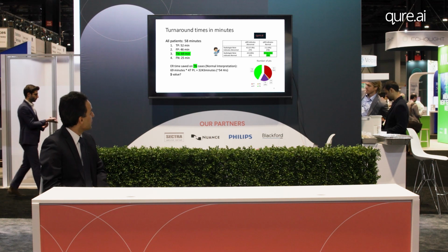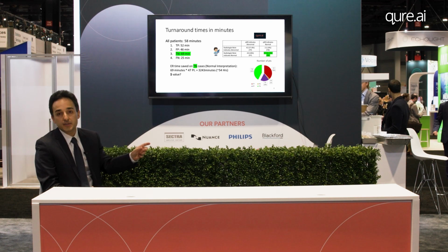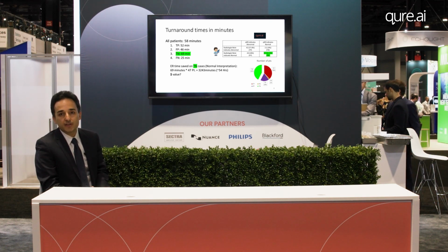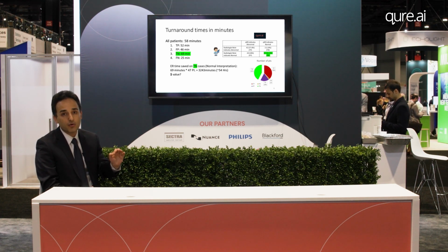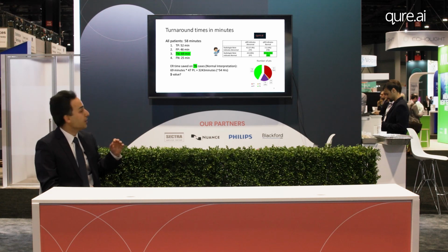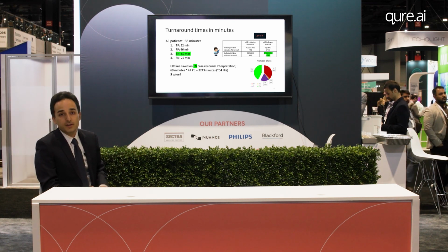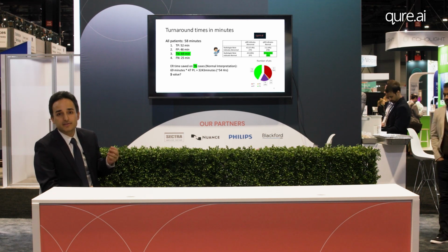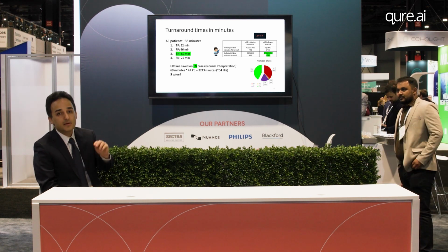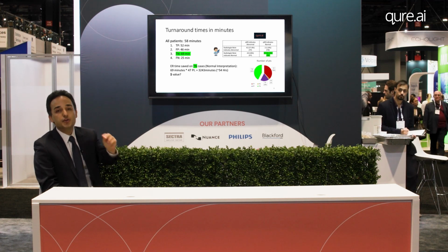Next, please. About the turnaround time, we looked at how much time we spend on each patient in the ER setup at the University of Louisville. On average, each patient was there for 58 minutes. This is the time between when the image was acquired and the dictation time when the radiologist signs the report. For each group, true positive, false positive, true negative, and false negative, the timings are different. Cases diagnosed normal by both the radiologist and the software took longer, around 69 minutes. That's the time we can save if we use the software.